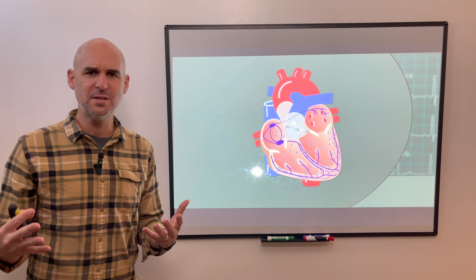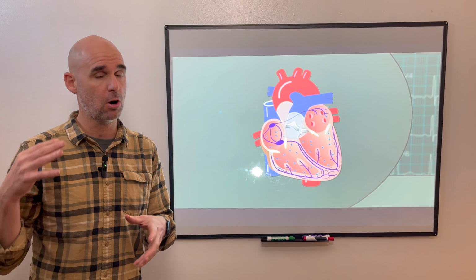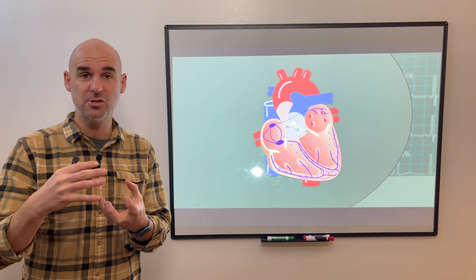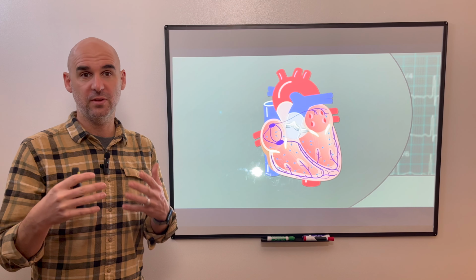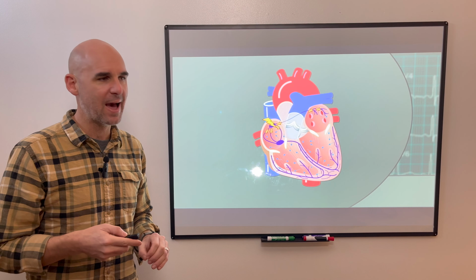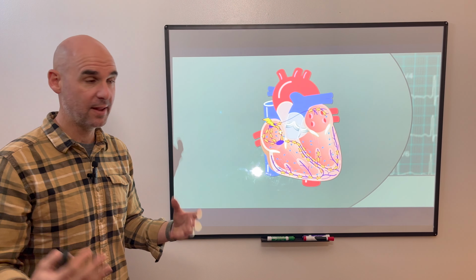Okay, so what are we talking about here in terms of axis? All right, normal axis, first of all. Well, we know that within the myocardium, we have lots of cells that are all kind of facing different directions and kind of straddled all over each other so that when the ventricles fire off, they kind of wring that ventricle out to eject the most amount of blood that it can, okay? So they're all firing in different directions. But what happens is when we have that initial depolarization that starts in that SA node and it starts traveling down the conduction pathways, as it does, it's going to tell all these cells along the way to also fire off. And that's through the power of conductivity, right? That it can do that.